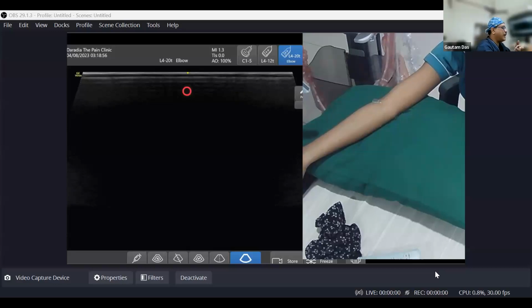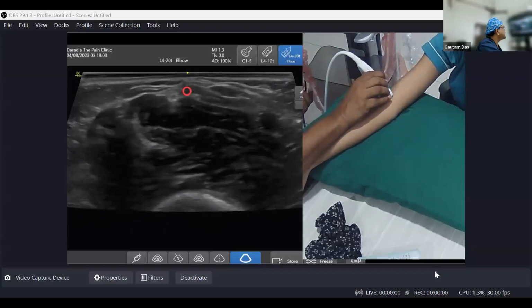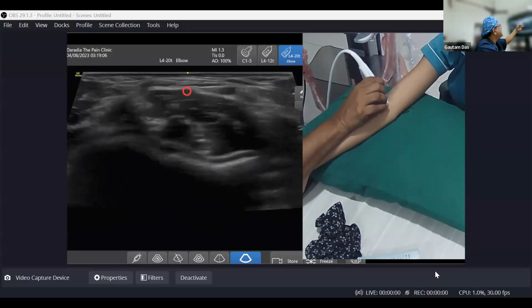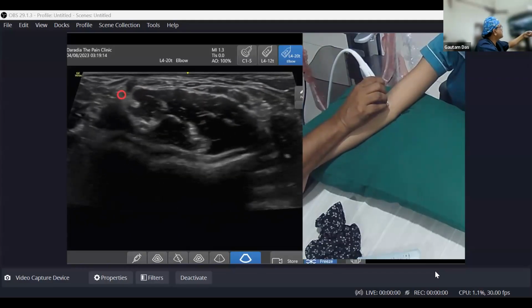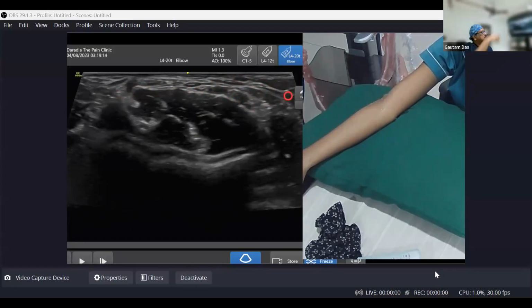Okay. So the bicipital aponeurosis, another name is lacertus fibrosus. So again, the home page. This was the home page, and here what you can see, this side is the medial or lateral side, the radial side, and the right side of the screen is the other side. So now at this position, these are the fibrous bands going above the median nerve and the brachial artery. This is the bicipital aponeurosis or lacertus fibrosus.